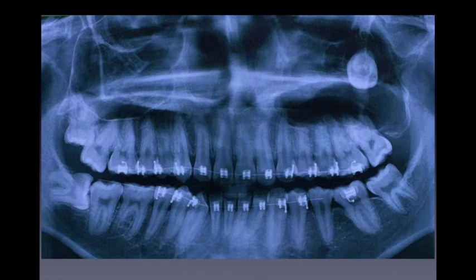Take, for example, a case that was brought to me initially with a plain film radiograph. I thought what any clinician might initially think of. It was a displaced, impacted molar, but something with the history, as I was discussing with the referring dentist and patient, seemed to be off.